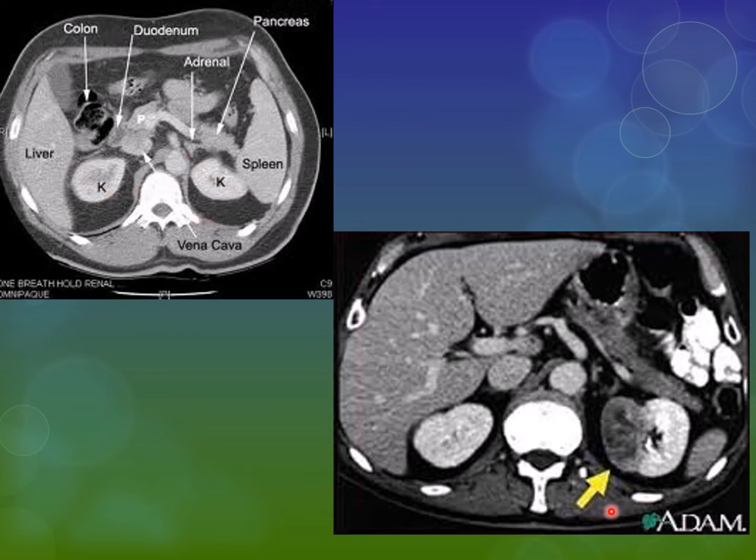Now let's come here. This kidney looks good. That's a good looking kidney. It's still got that area in the center where you can see it's a collecting system. But what do we have here? This kidney is completely misshapen. Here is the kidney, okay? Here is the tumor.